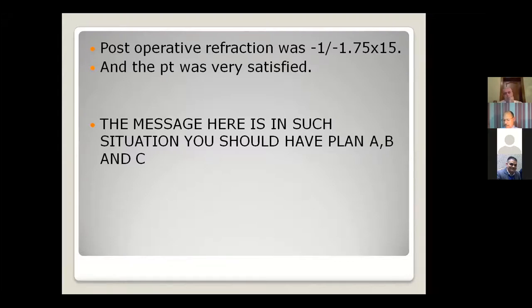Here the message in this case: you should have plan A, which is CTR, plan B, which is implantation of a PMMA IOL as a CTR with lower haptic. And even plan C, if you can't do that, you should be ready with a scleral fixation IOL. Thank you.